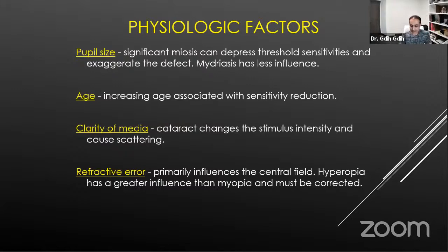Now, the trial lens holder, which is in front of the patient's eye, should be as close as possible to the eye to minimize the rim artifact of the lens. So that's one thing that should be kept in mind. Also, any refractive error should be corrected, and the machine actually gives you a calculation. It will calculate the age-matched accommodation to help you choose the lens for that patient. Any astigmatism that is 1.25 diopters or more should also be corrected before conducting the exam.